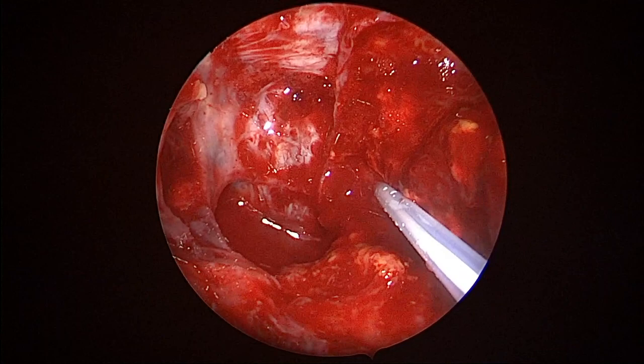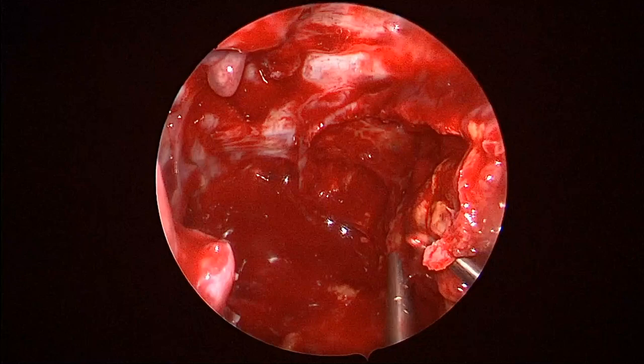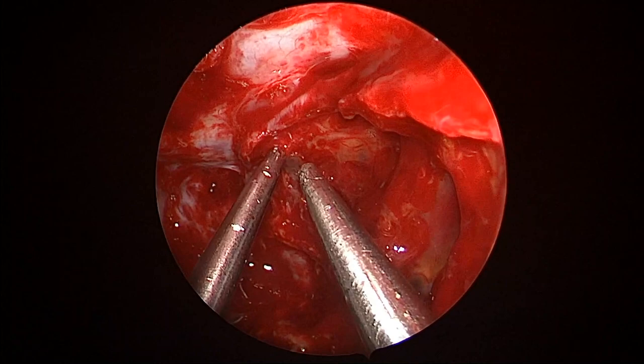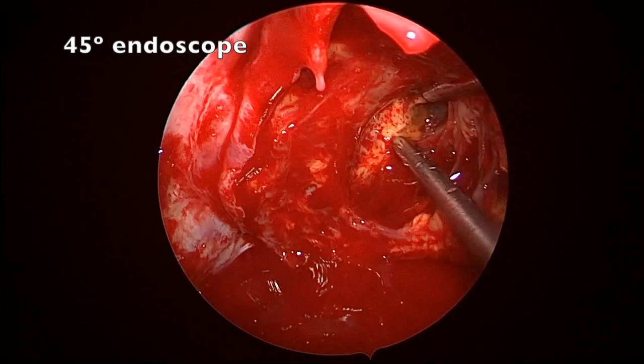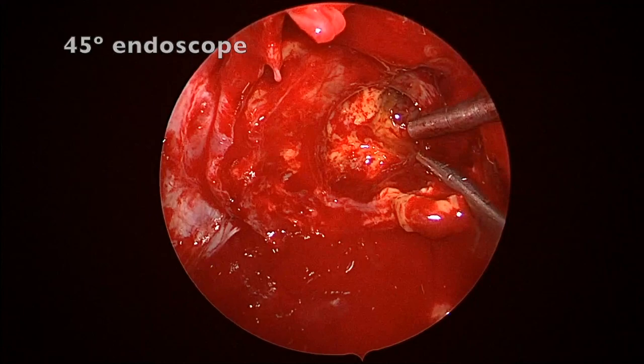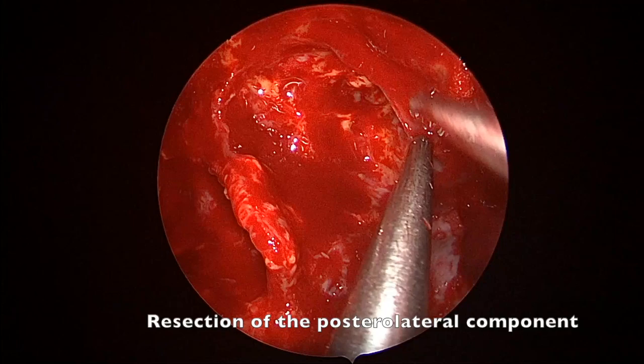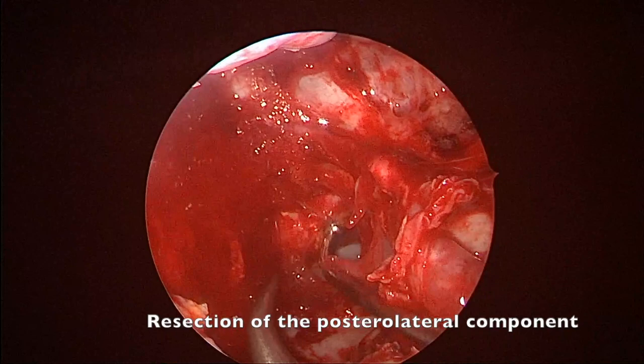Doppler was essential for safety in this case. Once the midline component of the tumor was resected, we moved to the lateral component behind the pterygopalatine fossa. We dissected the tumor away from the lateral aspect of the planum sphenoidale and the ventral aspect of the cavernous sinus. We decided not to go through the pterygopalatine fossa directly but used a 45-degree endoscope behind the pterygopalatine fossa to preserve its contents. We removed bone more lateral to allow lateralization of the pterygopalatine fossa, as seen in this portion of the video.